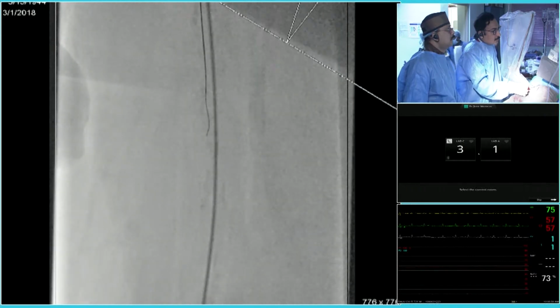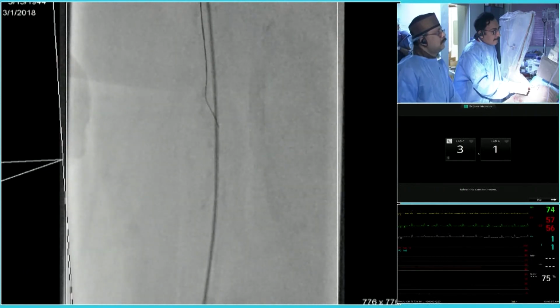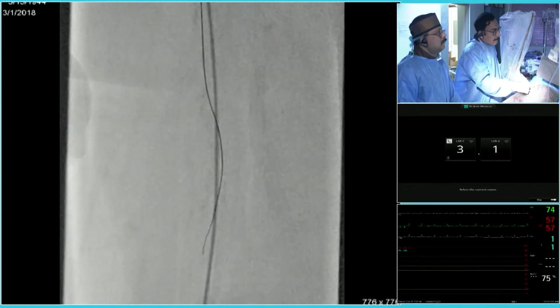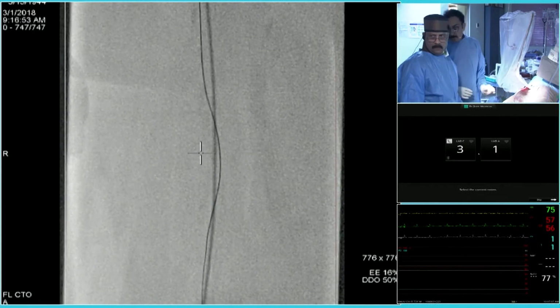When it comes back, you'll see a very long, diffuse area that pretty much defies any treatment. So although going from false lumen to true lumen and using a knuckled wire approach, etc., can work acutely, durability, to my mind at least, is very questionable.